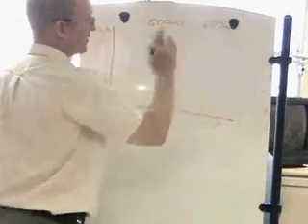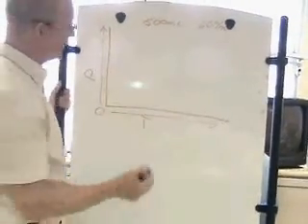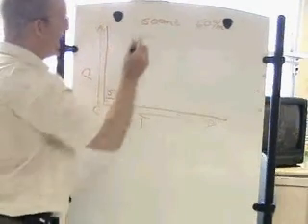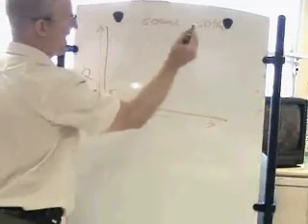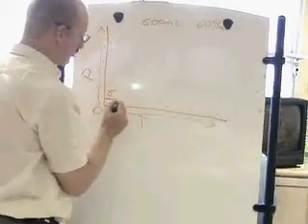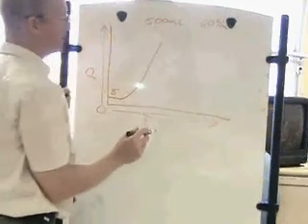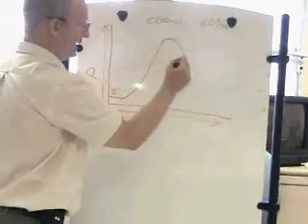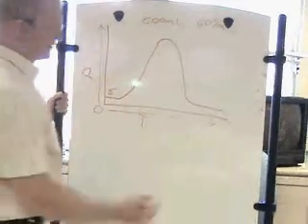Okay, obviously they're not the only ventilator settings, but as far as to describe this, they're the only ones that I need. My PEEP level starts off at 5 centimeters of pressure, and then as this 500 milliliters is blown into the patient's lungs at 60 liters a minute, the pressure goes up. Once that 500 milliliters of gas is delivered, the pressure would simply come back down to my baseline PEEP level, which is still at 5.